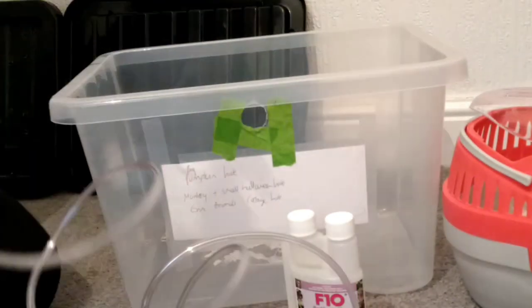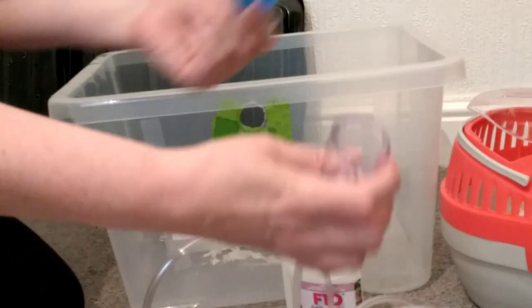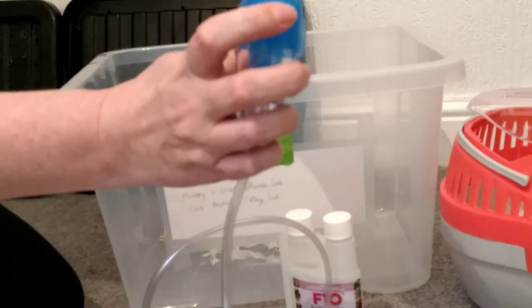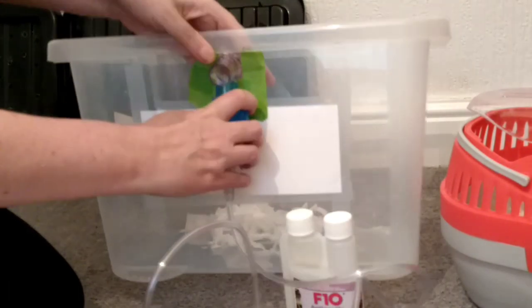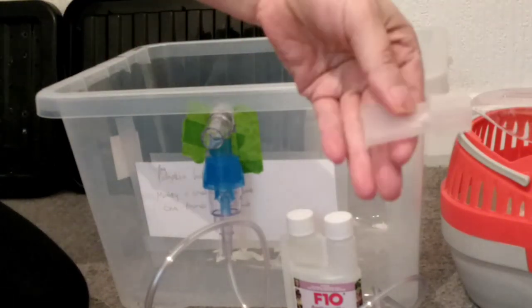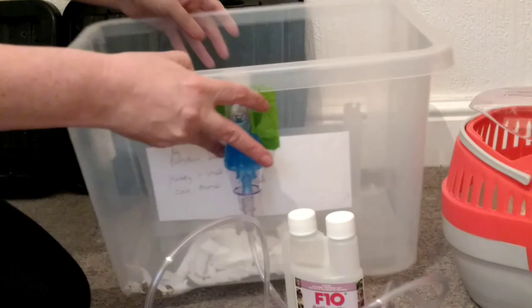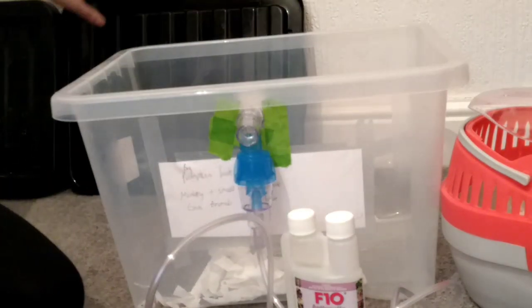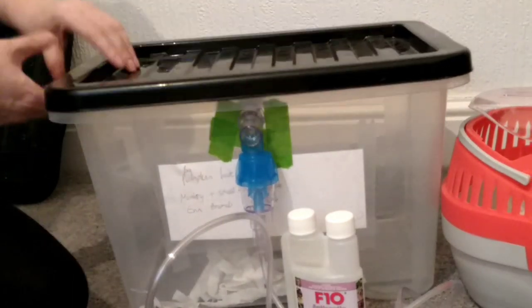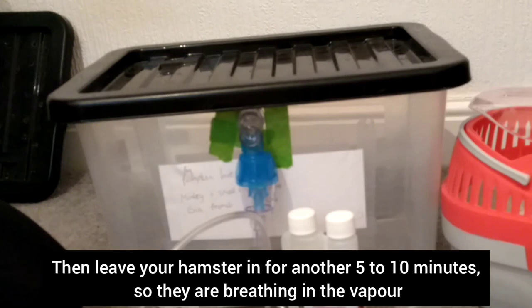So how it works: you have your nebuliser, you put your medicine in there, put the lid on, and then this tube here goes through the hole. On this one it's got a little funnel attachment, and you can just clip that on the other side. Then you put your little animal inside, put the lid on, and switch it on.